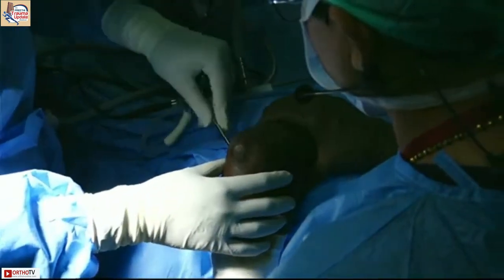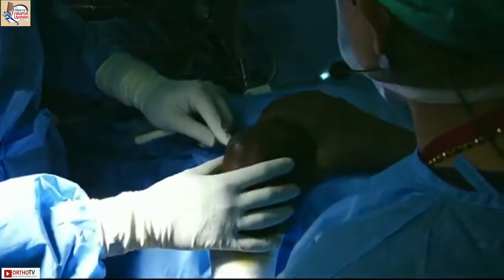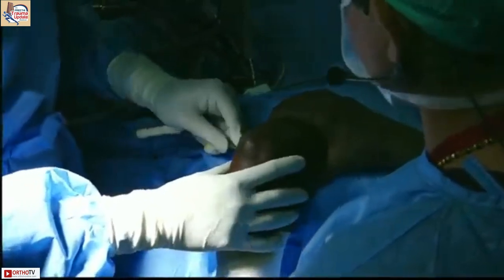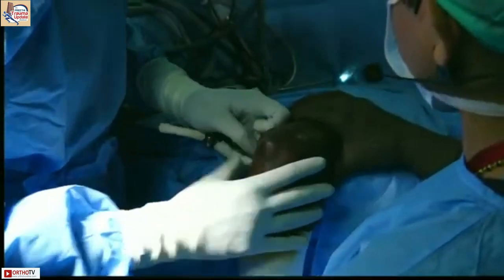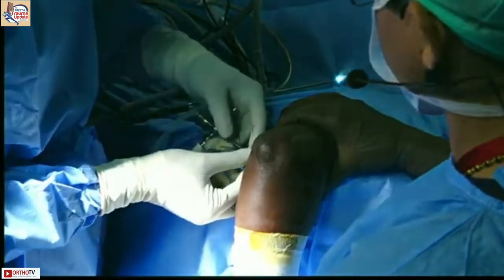So the scope looks big. What is the size of the scope? So the scope is a 4 millimeter scope. So you can do it with 4 millimeter. You can do it with 2.7. It's a surgical preference.